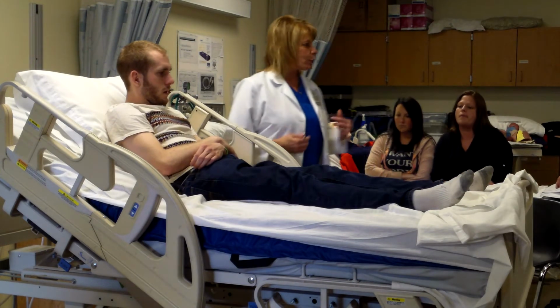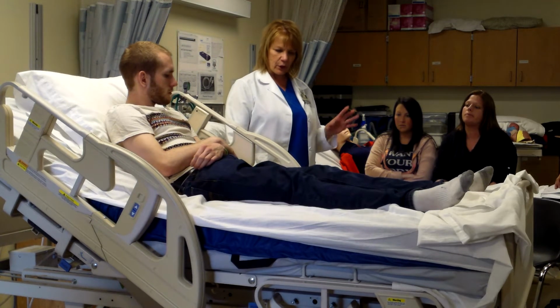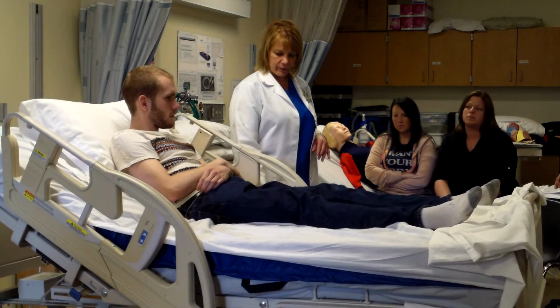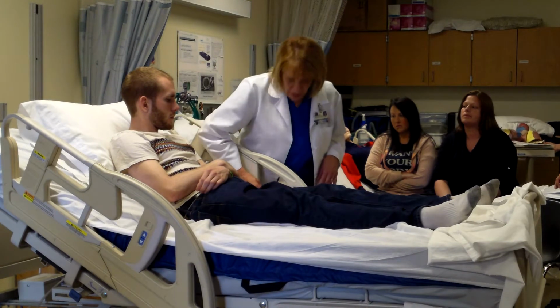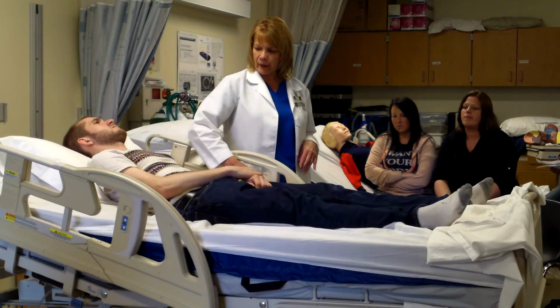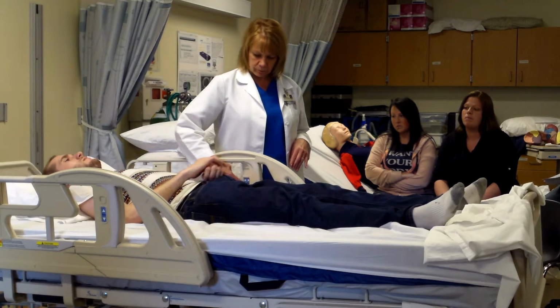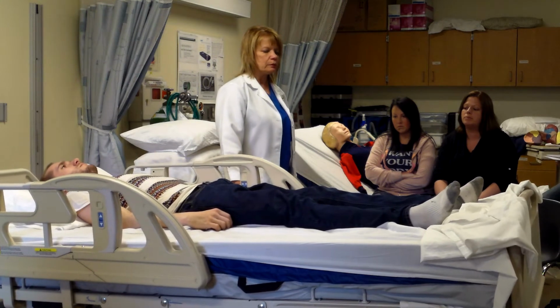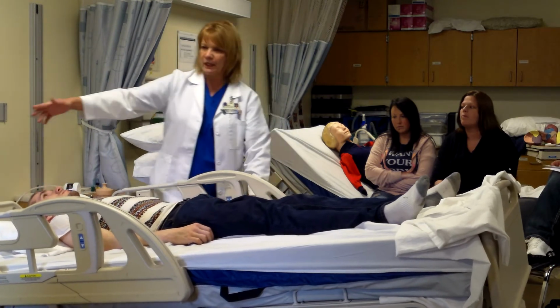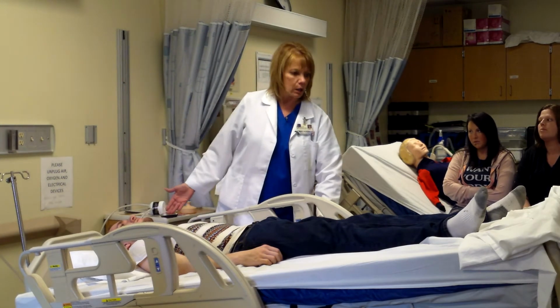Now what I'm going to do is start lowering the bed. It's going to latch, and the head's going to start to tilt down, okay? I'm just going to start to lower it now. So it's starting to tilt. I'm also going to put the head of his bed down because I need him flat. Here we go. Ready? You're going to make it go as far as it'll go. Please be careful. Watch the top. Make sure nothing's banging against the wall or anything and ripping stuff off the wall.